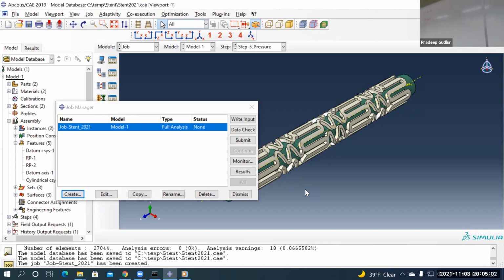Double click here. It's automatically going to take your work directory. If you double click on the folder, you see no file there. You should point to that folder. Job scan. If it gives errors, we'll come and fix it. Do you have any problems? No. Tools, you can run it and see what the problems are.